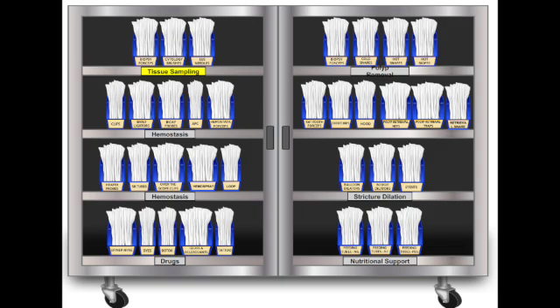What about the trap? The retrieval trap, or specimen trap. This is simpler but vital. It's a little container that connects into the suction line near the scope. Why? When small polyps are removed, sometimes they just get suctioned up through the scope channel. The trap catches them before they disappear into the suction canister, so they can be sent to pathology. Very important not to lose those specimens.